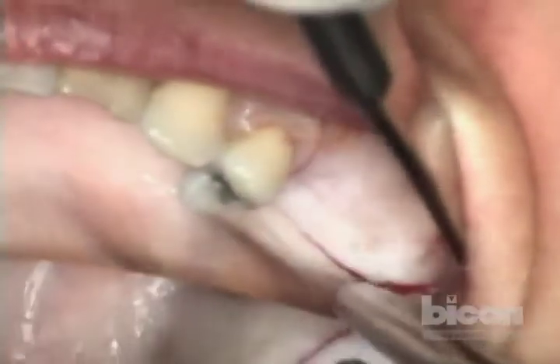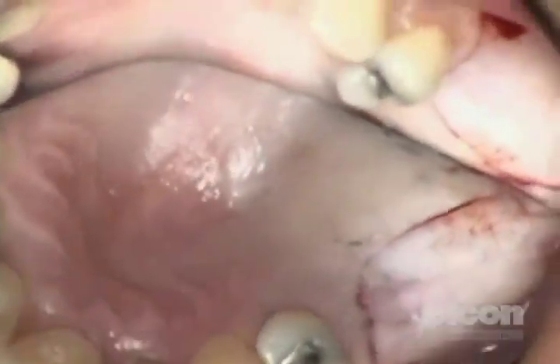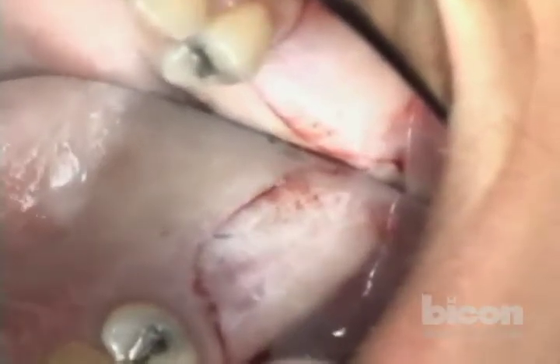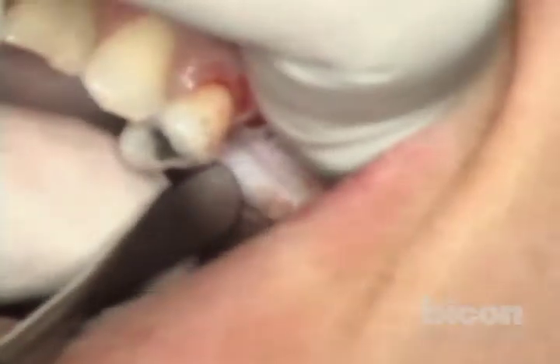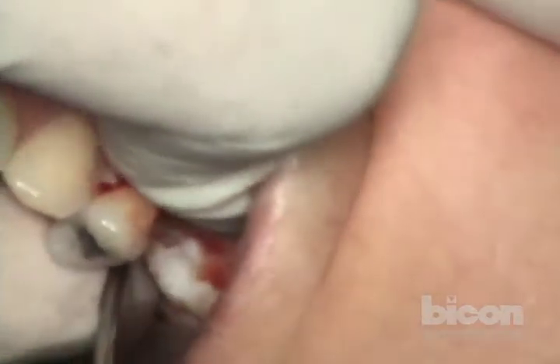You can see the incision we did. Now, the easiest way to elevate these kinds of flaps is to actually lever off your thumb — you want to feel bone all along the incision, then push with the left hand thumb and it peels right off.